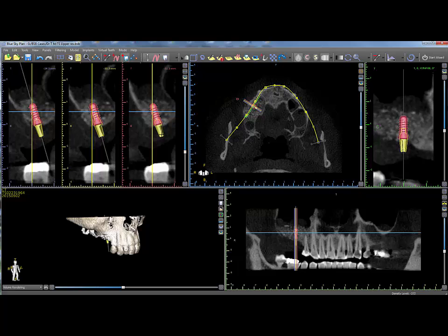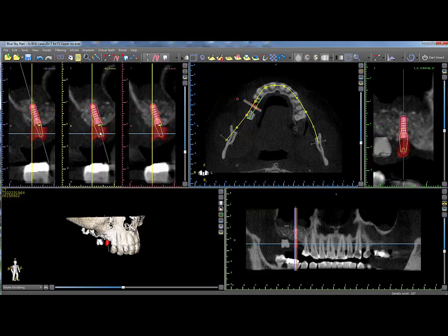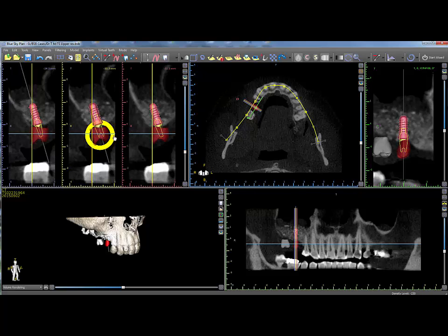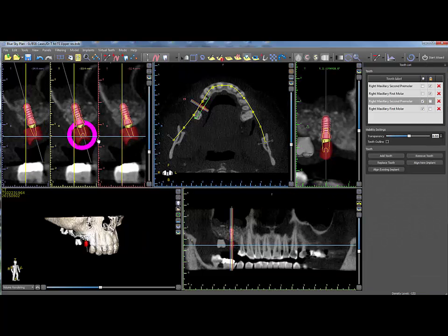Position the cursor in the desired location to drop the tooth down onto the image. A tooth can be repositioned by directly dragging it or rotating along the circular widget. Double clicking on the virtual tooth will open the virtual tooth panel with additional options.